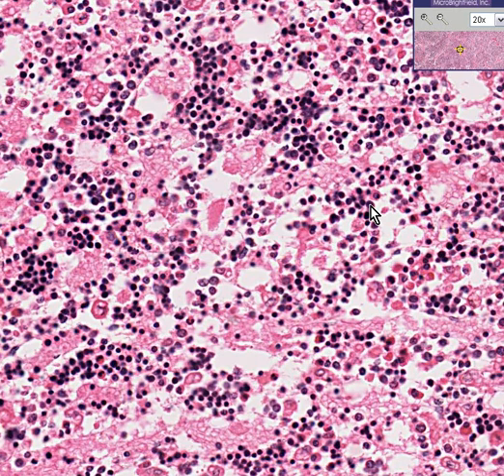You could see that the majority of cells within this field are erythroid cells. That's also unusual because there should be 3 times as many myeloid cells as erythroid cells. Or in other words, the M:E ratio in a normal marrow is about 3 to 1, but in this case, it may be reversed. It may be 1 to 3.